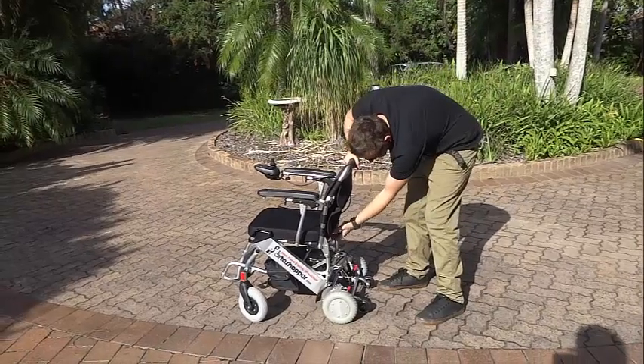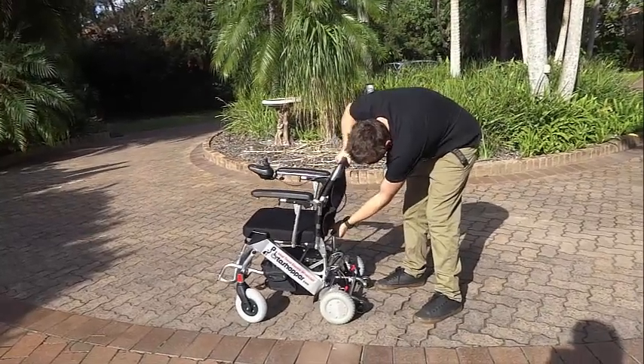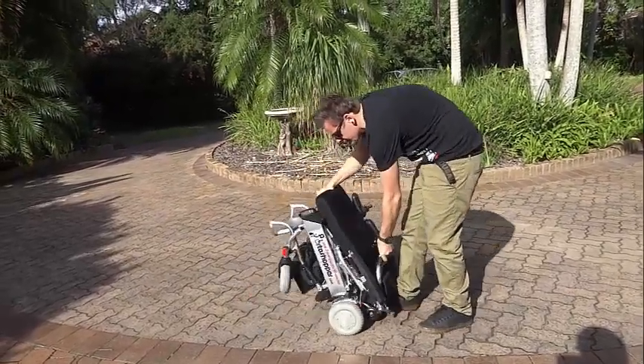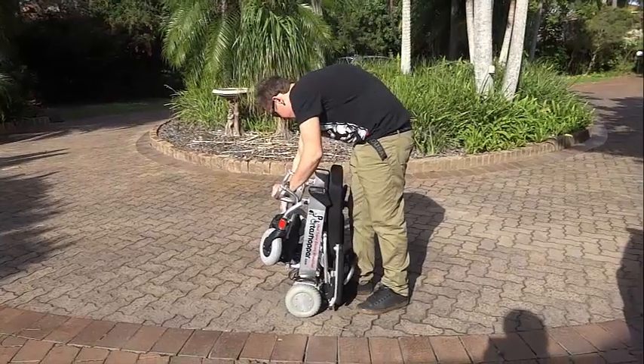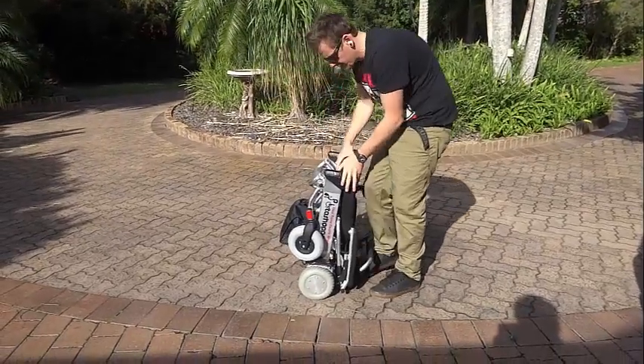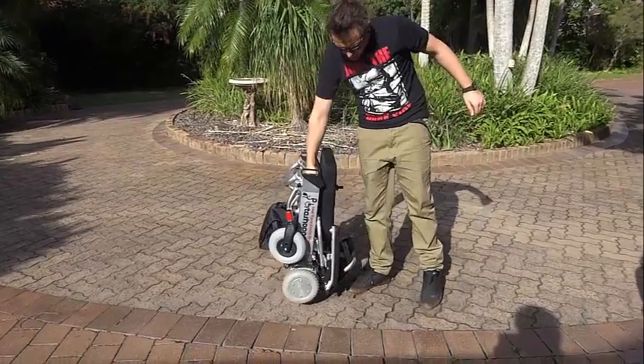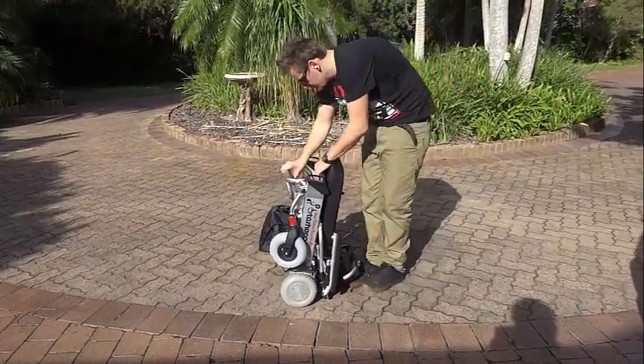To start off with, we have our entry level Porter Shopper 2, which was our first model and the one we started off with 4 years ago. It has some great features, starting with the fact that it is very light at only 20kg or 44lbs and with a very small footprint, making it highly manoeuvrable in narrow passages.